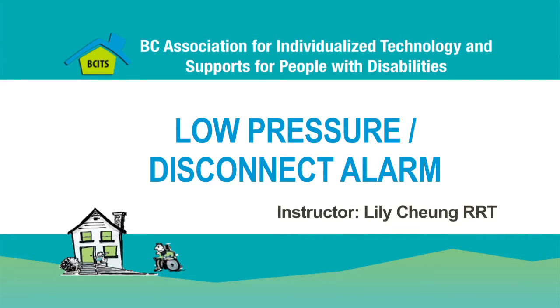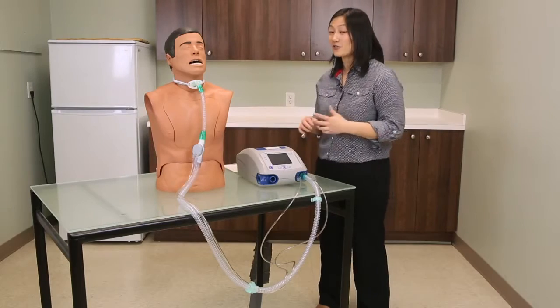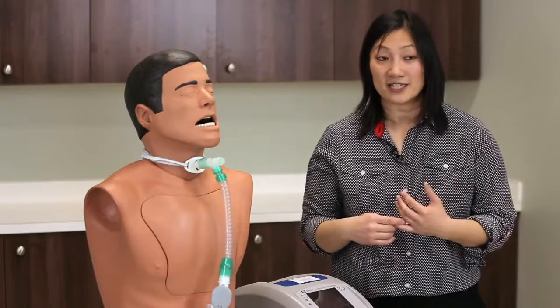Hello, my name is Lily, and in this video segment, we will review how to set up a low pressure alarm on your client's ventilator. A low pressure alarm, or patient disconnect alarm, occurs when the client's circuit is no longer attached to the client and results in the client not being assisted by the ventilator.